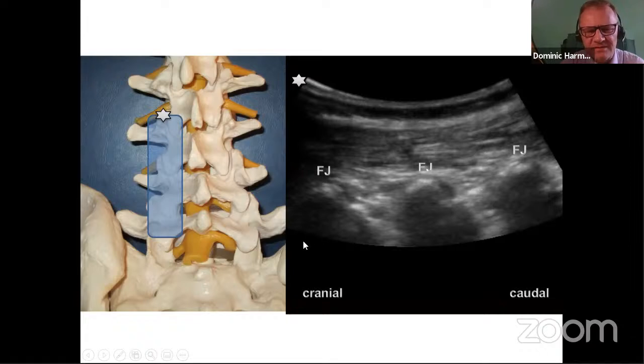In terms of joint injection, I mostly follow the technique of periarticular rather than intra-articular. I really don't see the benefit. Maybe a benefit might be if there was a cyst of the facet joint, that you might go intra-articular. In terms of an intra-articular approach, this longitudinal approach may be a better one, where you may be able to drop your needle into the joint from this approach, more so than coming from the side.